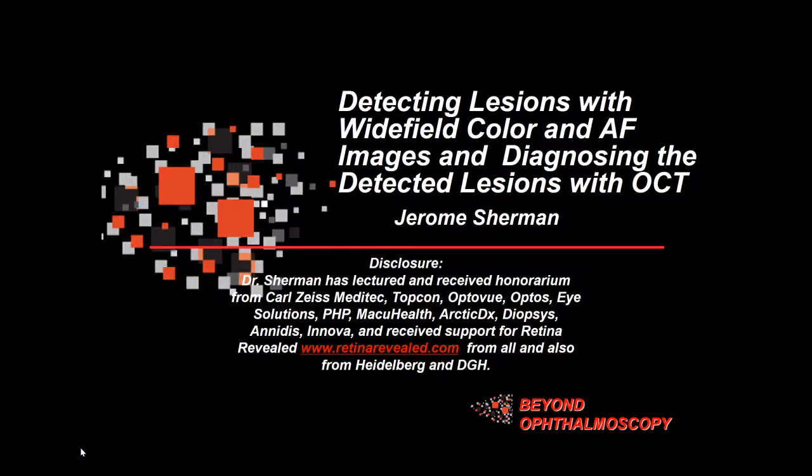Welcome. I'm Jerry Sherman, and the first lecture today that we're going to be covering is detecting lesions with wide field color and autofluorescent images, and then diagnosing the detected lesions with OCT. Rather long title. I hope it makes sense to you.